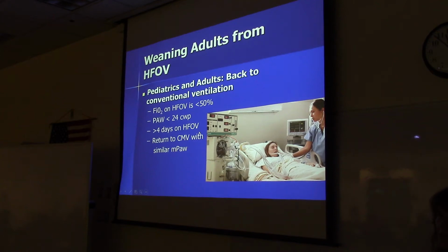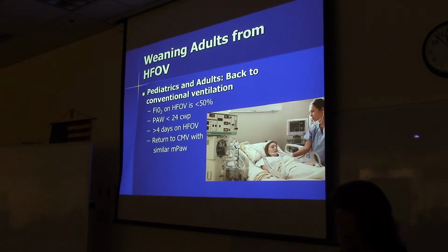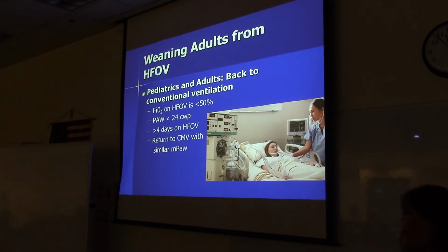to allow the lung injury to repair itself. So it's not like you get a good blood gas, all right, got a good blood gas, let's take them off, put them back on conventional. So they're recommending a minimum of 4 days before you take them off the oscillator.